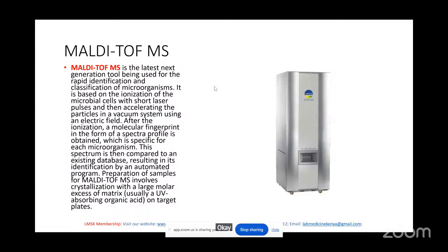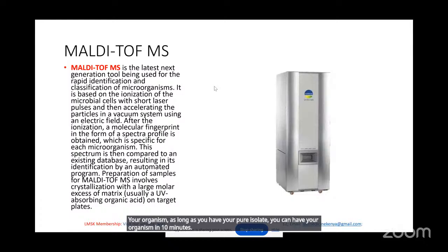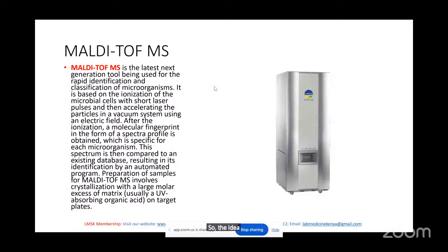Okay, so for MALDI-TOF MS, again, we've just talked about it. It will give you your organism, as long as you have your pure isolate, in 10 minutes. So the idea is to reduce the time from when a patient has come to the hospital and their sample has gotten into the laboratory and they have started empiric therapy. So you're trying to reduce the time from empiric therapy to a guided therapy.